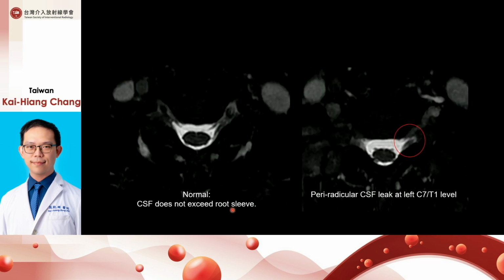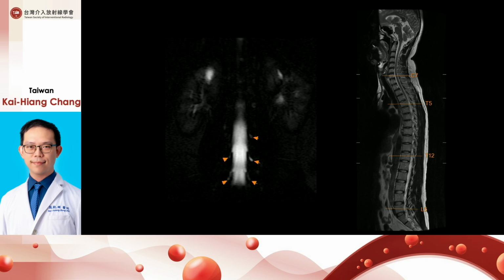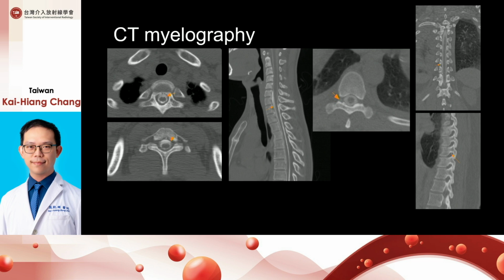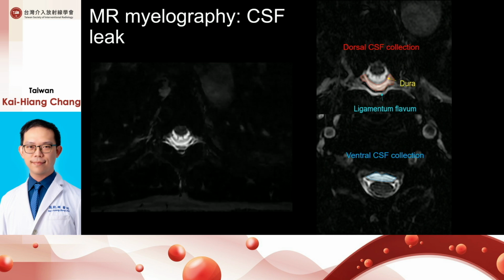Okay, on the left-hand side is a case, an example of CSF leakage.